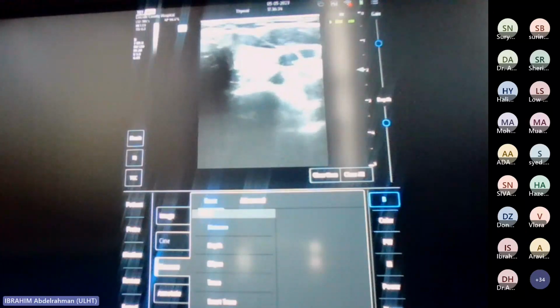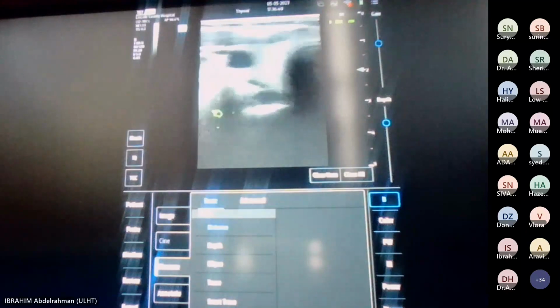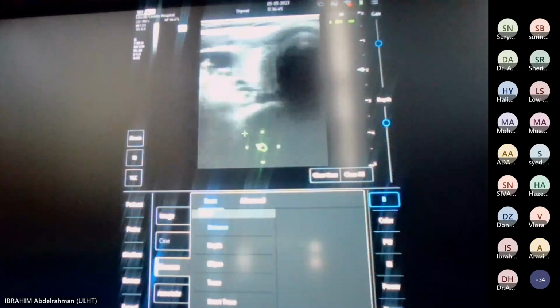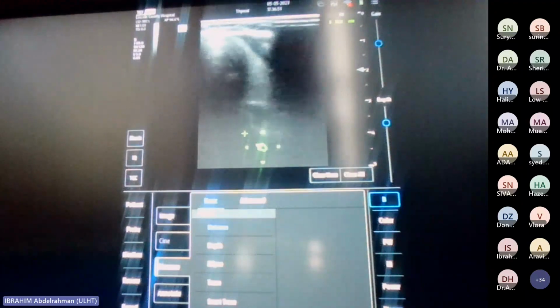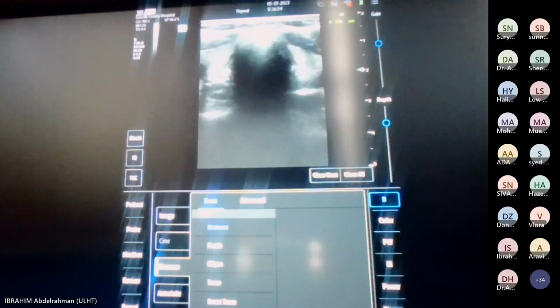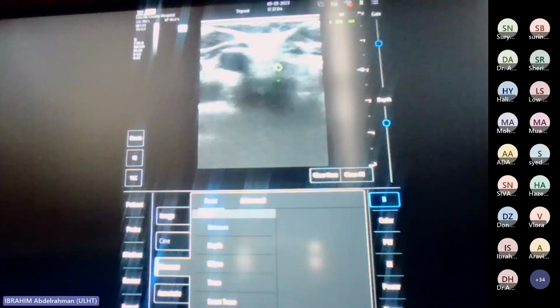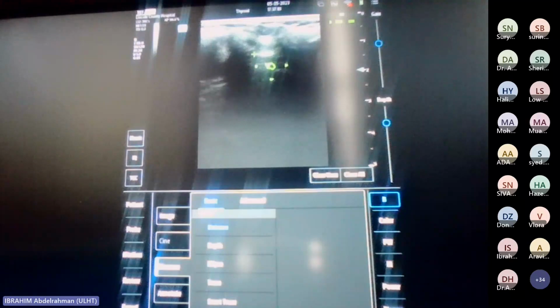And then, like I say, we can see the carotid artery and then the internal jugular vein on both sides. Carotid artery, internal jugular vein. So level 6 lymph nodes are in the midline, so either side or in between the carotid arteries. So this is level 6. It comes all the way down. We can't see level 7 on ultrasound because that's when we would get to the head of the clavicles and the sternum. We would need CT to have a look at level 7.